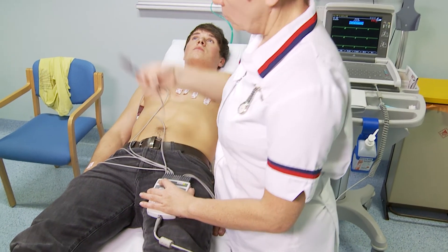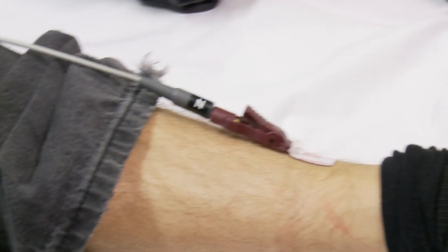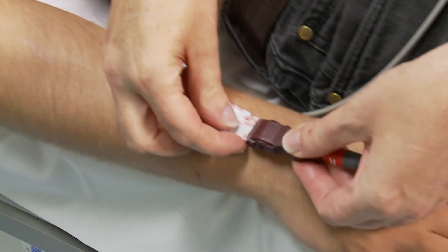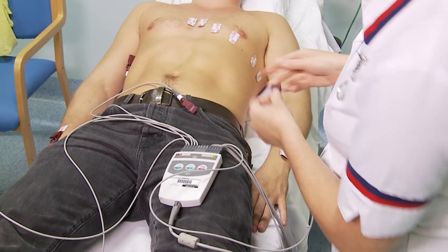Attach the limb leads to the electrodes as follows: on the right lower leg, place the black lead; on the left lower leg, place the green lead; on the right forearm, place the red lead; and on the left forearm, place the yellow lead.